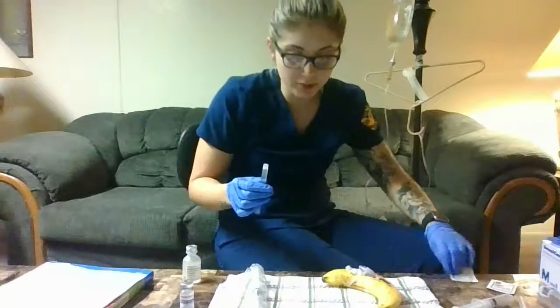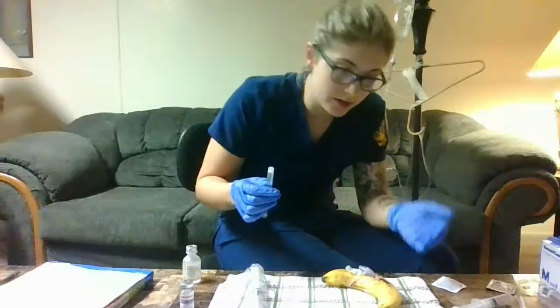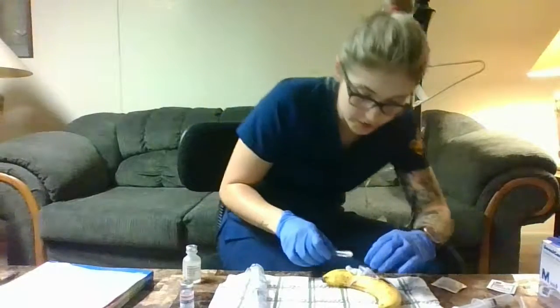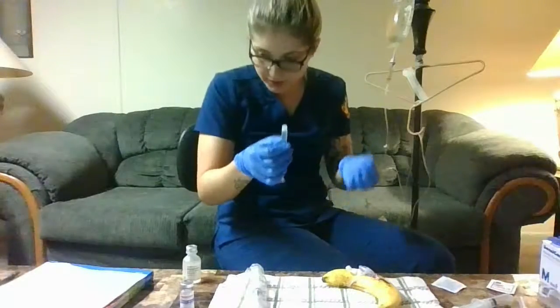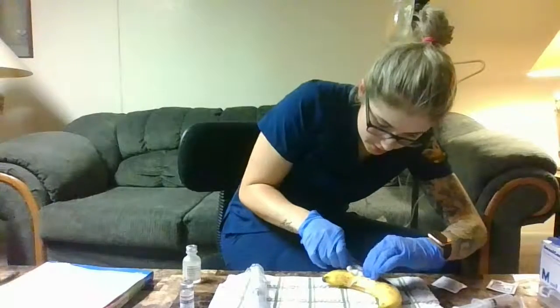So you already cleaned the port here. You checked for any tenderness, pain, redness, swelling. That all looked good. So you're going to administer your medication. We have the 3 milliliters. It needs to go over 2 minutes. So 1.5 milliliters per minute. Going to twist it in.